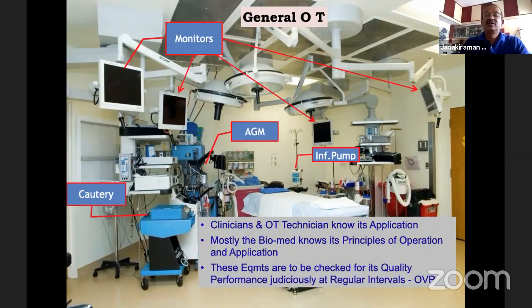Monitors are second category equipment. Whether they work or not, the patient is not going to be affected. But if the performance of anesthesia gas machines and infusion pumps fails, the outcome for the patient will be a disaster. So clinicians and OT technicians know the application. Doctors do not know the principles of operation of the equipment, but they know the applications.